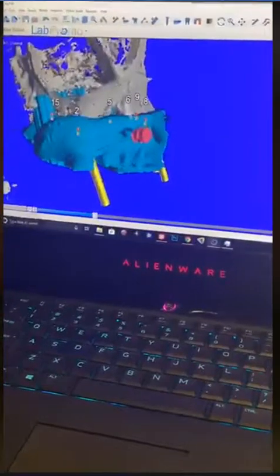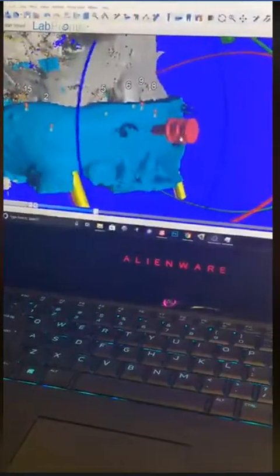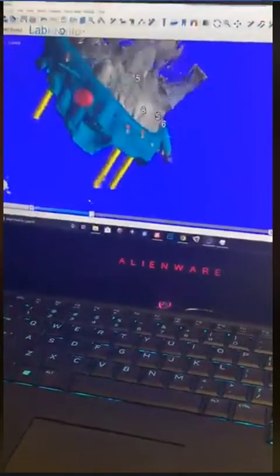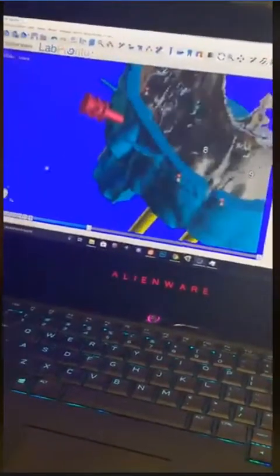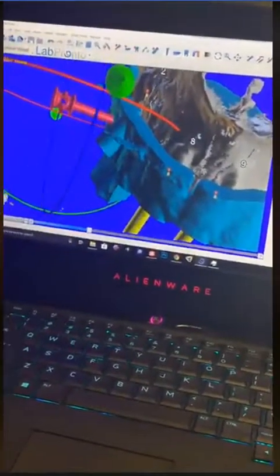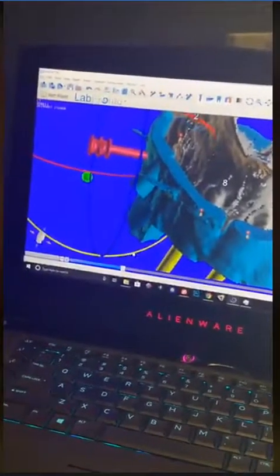When you drop a pin inside, okay, you have to play around with the pin to make sure that it's in the right spot. So let's just, for argument's sake, say that this pin is in the right spot. I'm just going to pull it out. Let's just move it a little bit.